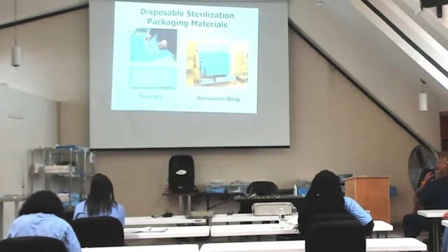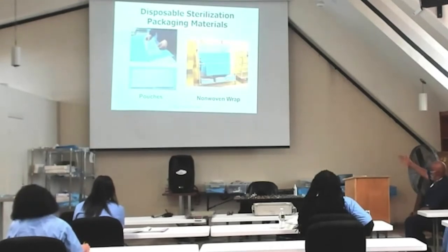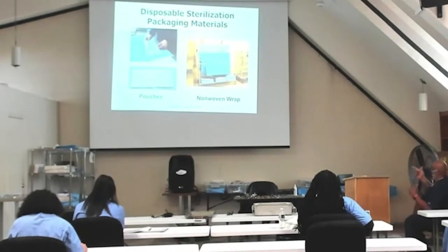We're looking at materials, okay? That rack that you see, remember I was telling you guys have the different size rack. The top shelf would probably be 54. We rarely wrap things that big, but we have it just in case, all right? 45 is the most frequent use. Then you have your 36, your 24, and I think the smallest might be 18. It's probably not on the rack.